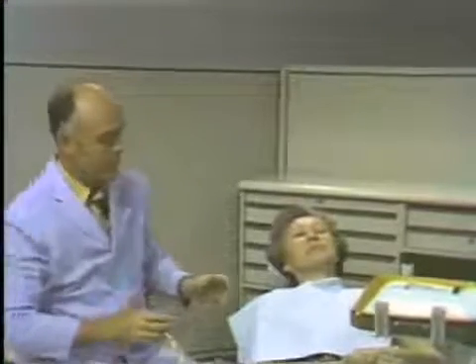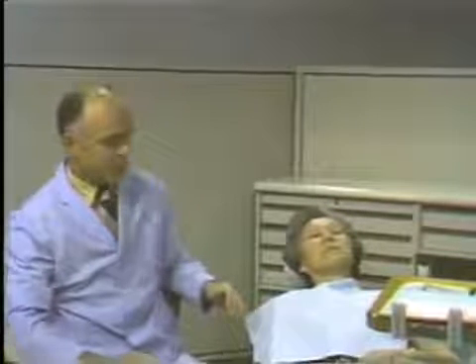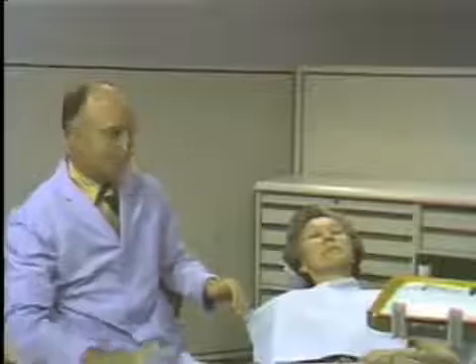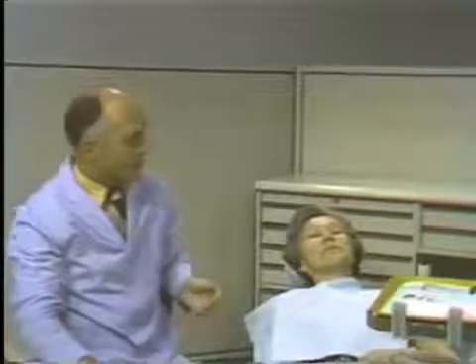The solution is to have the patient and yourself in correct posture and correct chair position. If this is not possible, it's always possible for the operator to stand and give the anesthesia from a standing position.